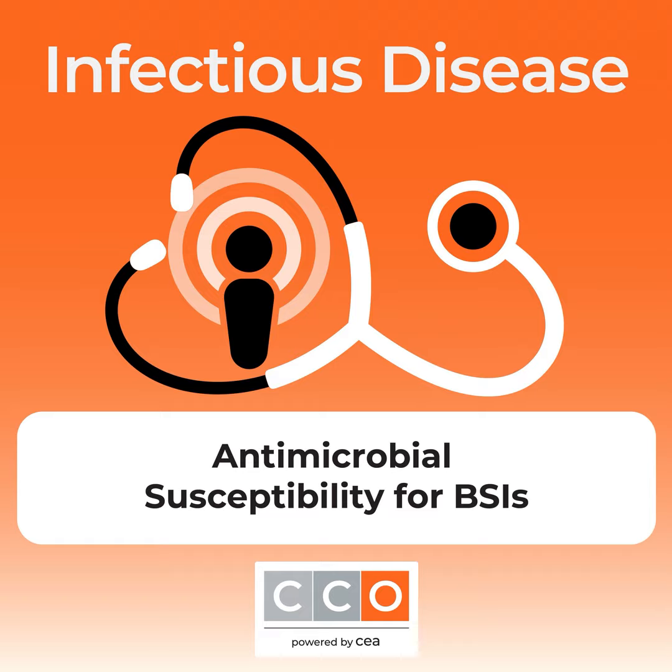Antimicrobial resistance is multifactorial. But one advantage that we have right now with the Enterobacterales group is that most of the beta-lactam resistance is very well defined based on beta-lactamases. We have ESBL, where CTX-M is the most predominant gene circulating and can be identified using rapid BCID. We have a group of carbapenemase genes that can also be identified. We know that other mechanisms that we cannot identify, like porin restriction and efflux pumps, play a significant role.